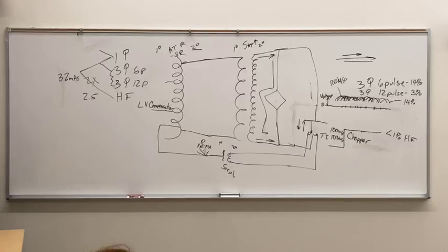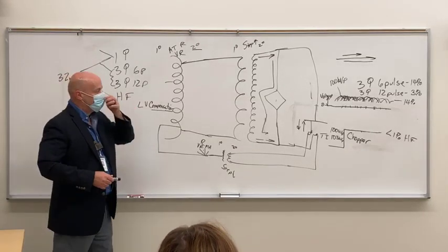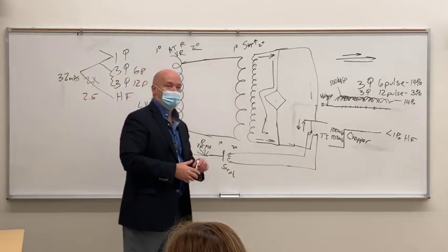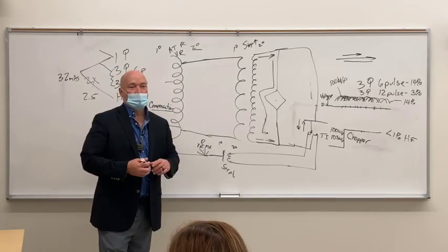But you're probably never going to see that. I haven't seen a single-phase machine in a hospital. That was the only hospital I ever saw a single-phase machine in. All right, so any questions on single-phase, three-phase, high-frequency, single-phase, half-wave? Yep. What if you go from a three phase to a high frequency though? Do you ever do that? No, you really don't have to do anything.